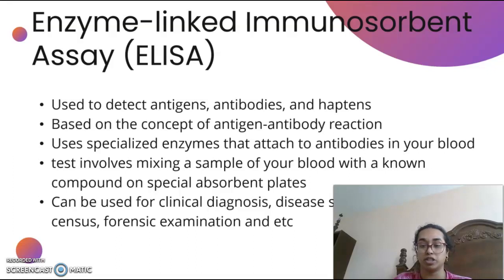uses various specialized enzymes that attach to antibodies in your blood, and so as a result, this test involves mixing a sample of your blood with a known compound on special absorbent plates. And depending on what your doctor is diagnosing, the test can use various types of enzymes in order to identify the various types of antibodies that can be tested for.